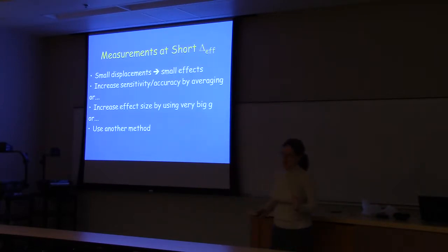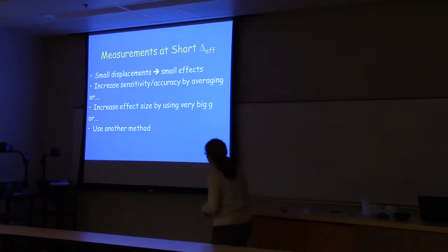And it turns out from that UK study, it wasn't dB/dt that mattered, it was B times dB/dt. So the higher the field strength, and I use very high field strength, especially compared to clinical, the worse it is, and the slower you have to go. For those of you taking clinical scans, don't worry, there's all sorts of things programmed into the scanner to protect you from anything happening. For my mice, sorry to use.